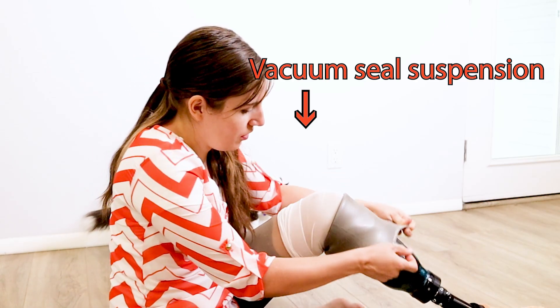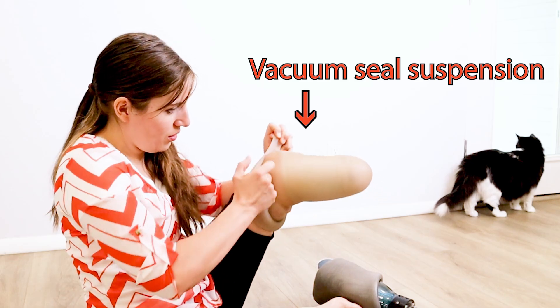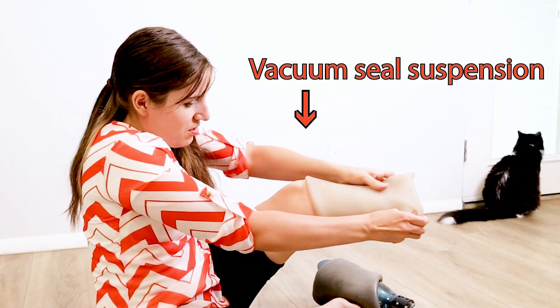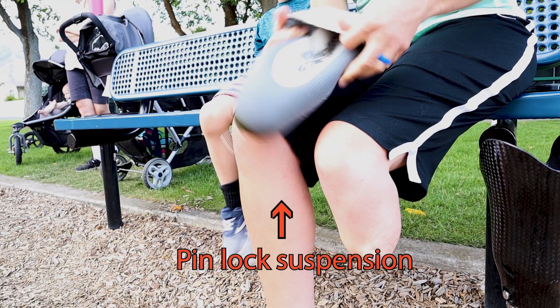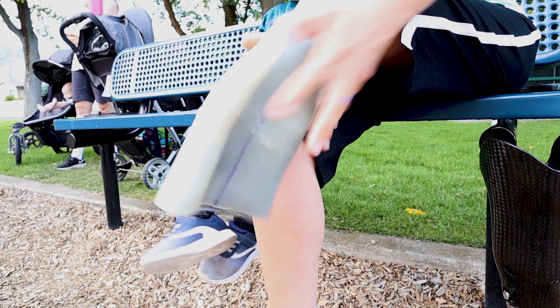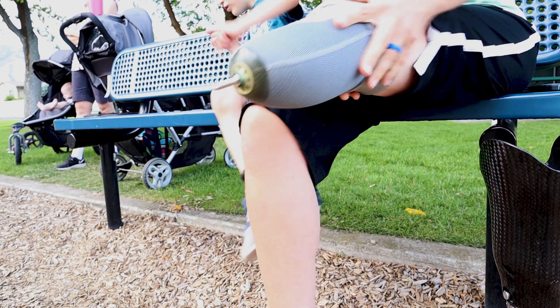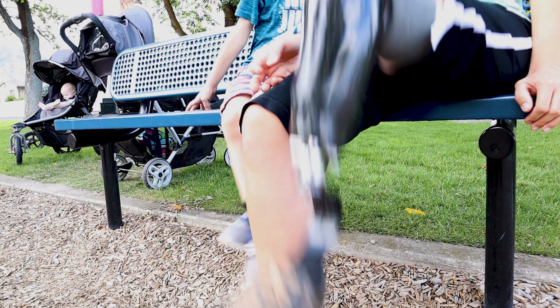The system that holds a cyborg leg onto a human leg is called a suspension system. Having my very own suspension system makes me feel like a race car. Having used both vacuum seal and pinlock suspension systems, I can tell you that they have different pros and cons — those are things you can discuss with your prosthetist when choosing a leg. What's best for you depends a lot on your individual situation, which can evolve over time. I stopped using vacuum seal because my leg developed a bursa and the vacuum was making things worse.